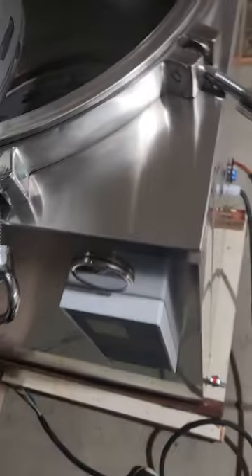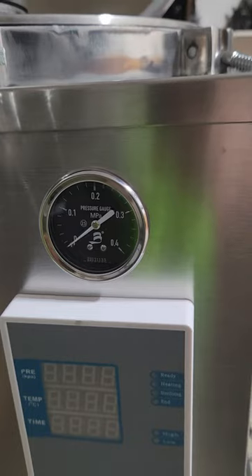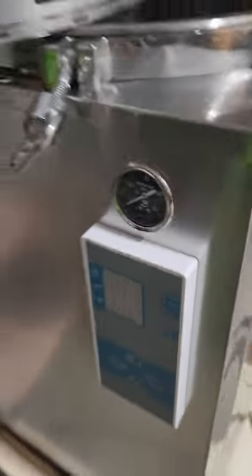Looks like a pretty good unit. It's pretty heavy — pretty heavy duty. Got your control panel. Pressure. Gotta get this thing hooked up.